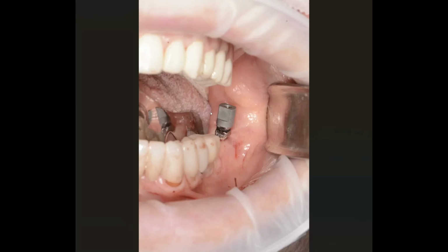And then, inconveniently, you would have to perform all on four surgery around the fiducial, being careful not to disturb it. It would stick up high into the work field. It would get in the way of your armamentarium and your drills. And they would tell you, okay, place your 4 implants, don't disturb the canine, don't disturb the fiducial. And after you get all the scanning done, you can then remove the fiducial and you can remove that last canine, and then you can finish your alveoloplasty. And to me, it was messy.